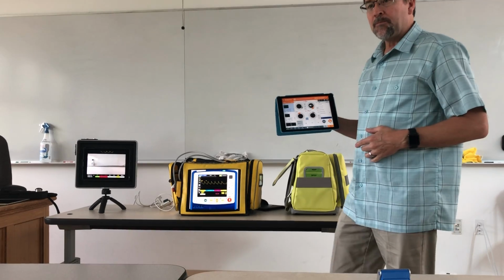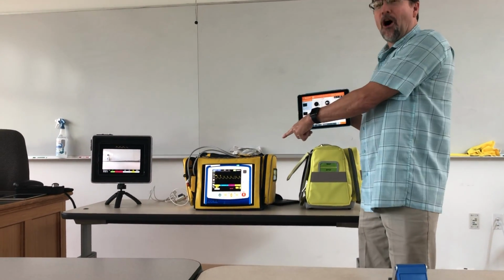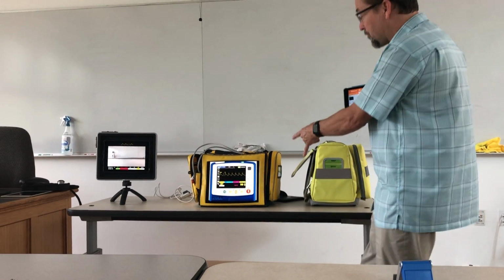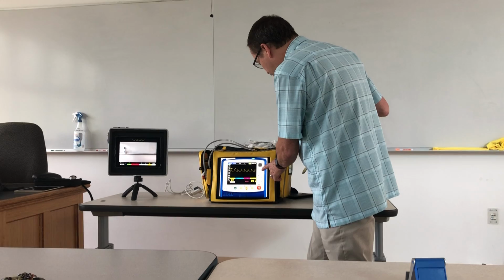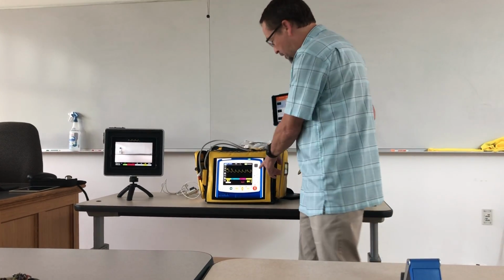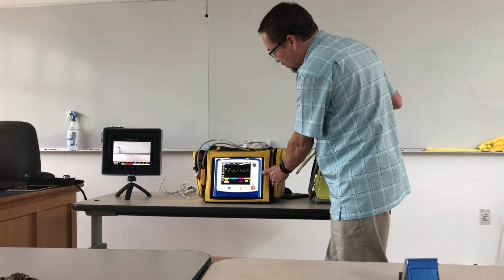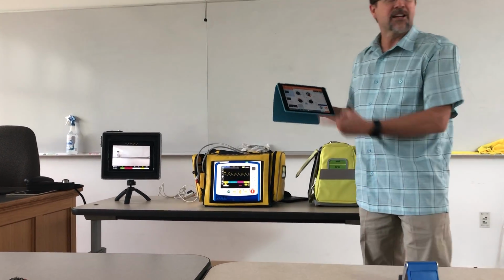Can a student do that from their monitor to turn off their alarms? They can do it exactly the way they would on that monitor. So if they're familiar with the Zoll, which I'm not as much, if they want to go to the, I think it's up there. Yeah, so if it's alarming, right now that was just the heart rate one, but if an alert goes on and they hit the alarms button, it'll toggle the alarm on and off just like it would. And that's what's cool about this.